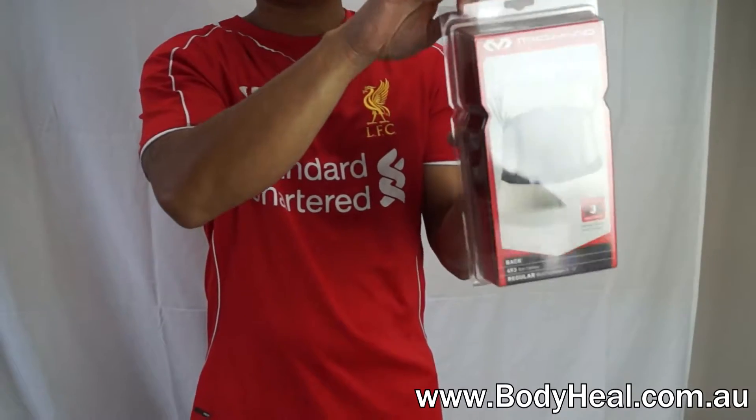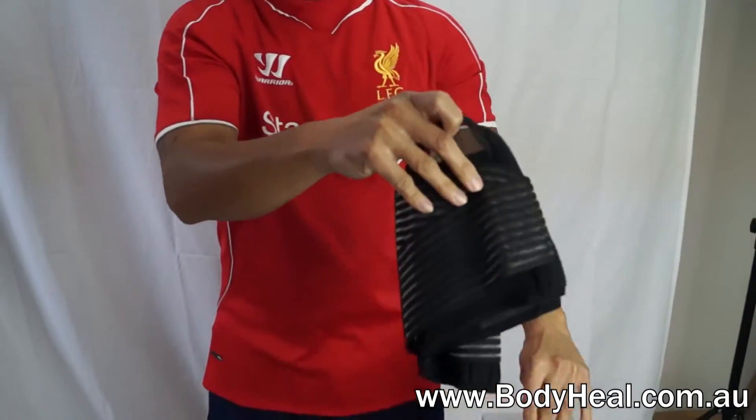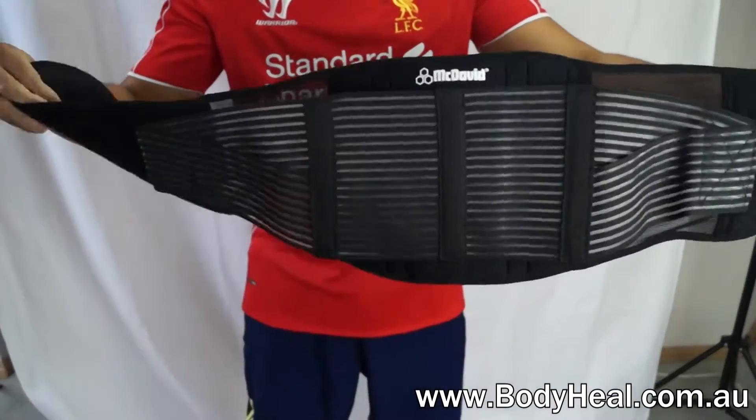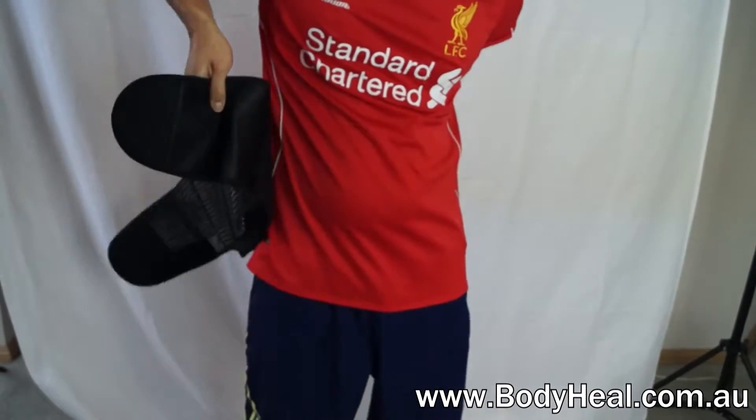The McDavid Back Stabiliser provides maximum support for the back and helps with pain related to injuries. It works by providing therapeutic heat through thermal compression, as well as six spring stays that are strategically positioned.